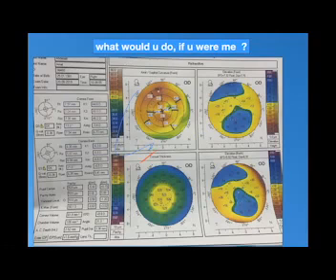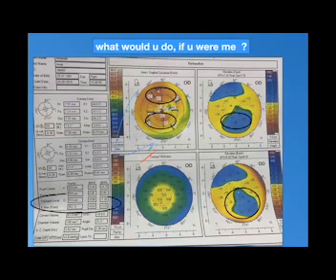If you stop at the Pentacam, the sagittal curvature or the topography is not good. So you will explore this patient and not do any refractive surgery because of these figures, right? According to the risk factors on this Pentacam, yes, which is signed. Look at the black ovals and the circles.